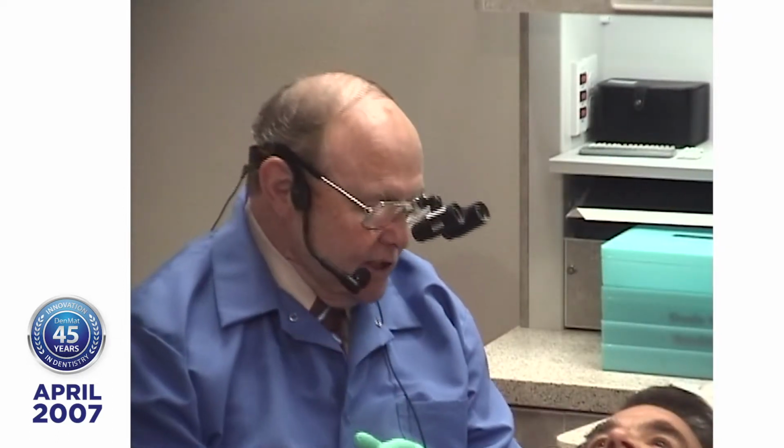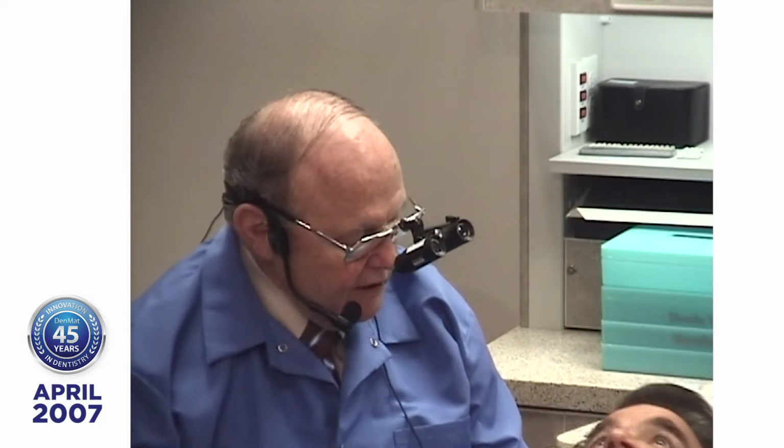We're going to do a live placement of Lumineers today. We're going to place 8 porcelain veneers on this patient. No grinding on your teeth and no injections. And we took an impression. Yep. We did try them in and select a shade. Okay. And to save time today, we won't go through a lot of that process.